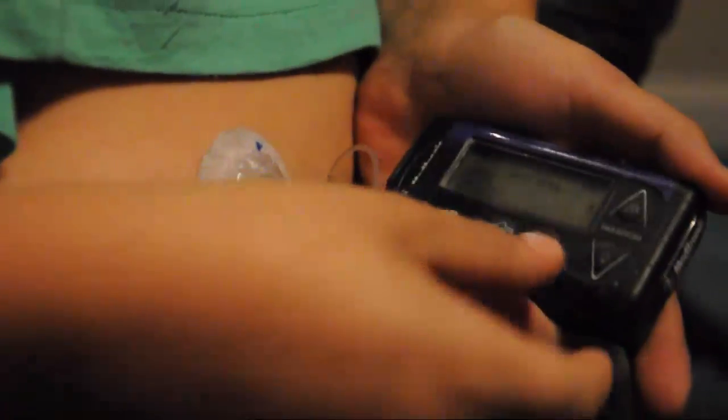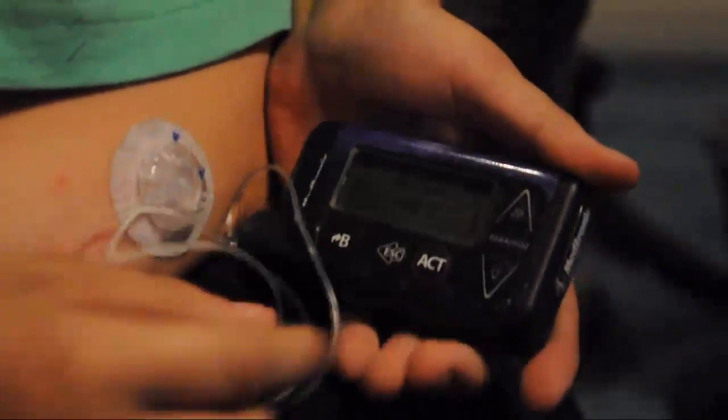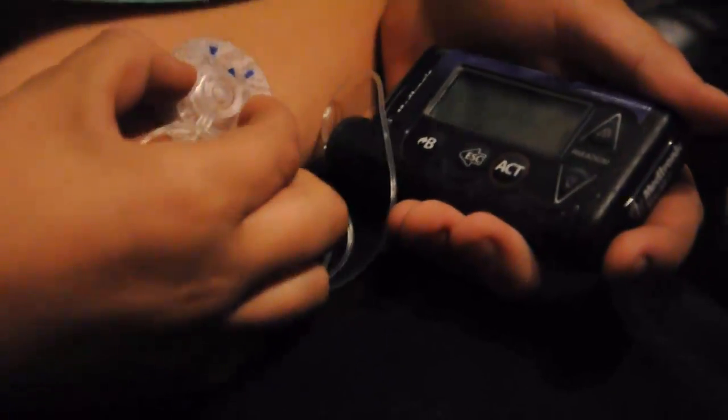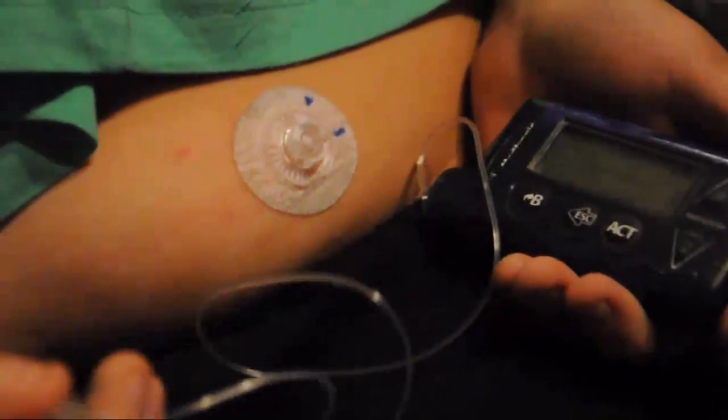First I press Act and go into the menu, go down and then I go to the bit where it says Reservoir and Set. Press Act and then I go to the bit where it says Reservoir Setup. Press Act again and then it asks me to disconnect the tubing from my body. So what I need to do is I just need to twist this like that and it comes straight off.